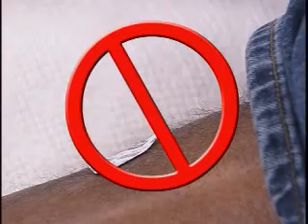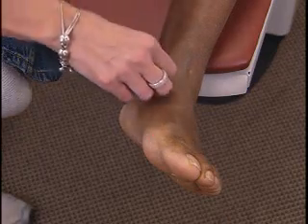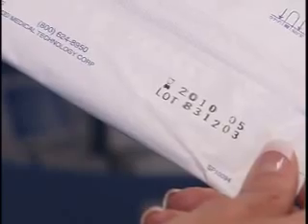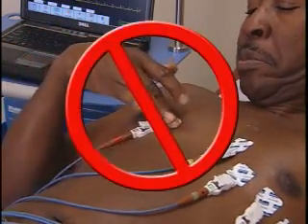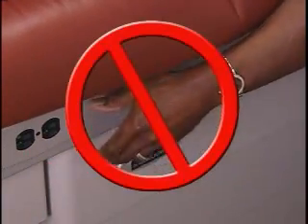Here is a list of items that may cause lead quality problems and should be avoided during the ECG test. Improper or no patient preparation before placing the electrodes. Patient movement or talking during testing. Improper electrode placement. Dried, loose, or expired electrodes. Check the expiration date on the package if you suspect the electrodes may be expired. Patient or clinician touching the electrodes during testing. Patient touching any metal parts of the exam table or bed they are lying on.